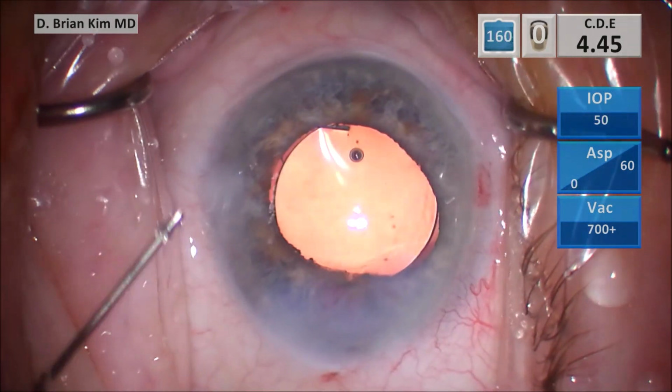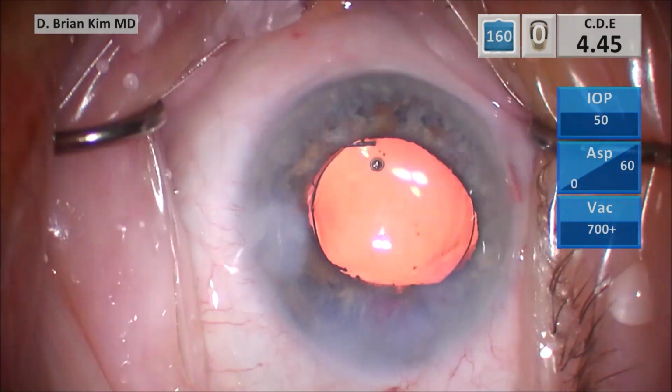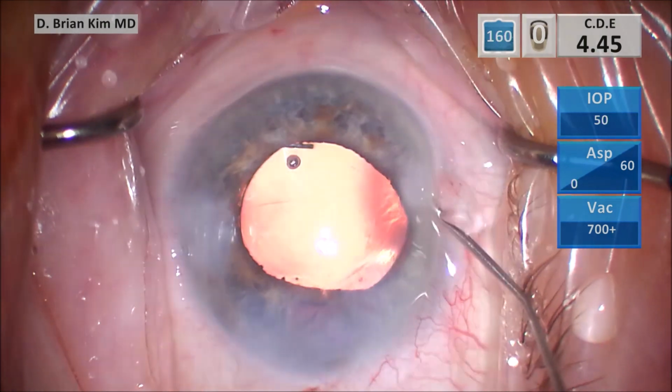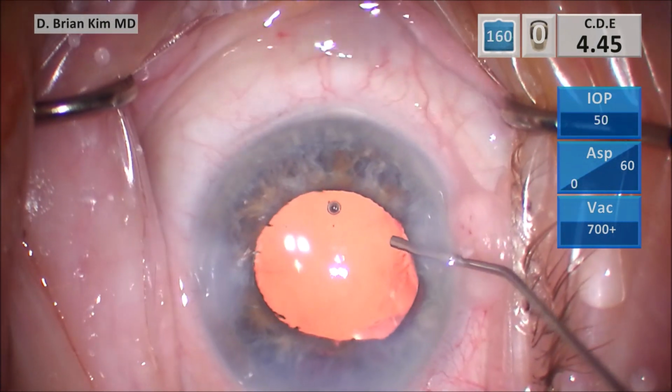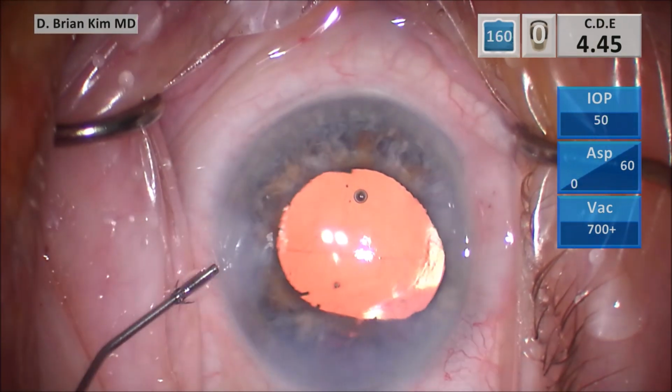And so you saw I was able to very carefully, mechanically fracture the lens pieces into smaller pieces, very controlled, systematic lens disassembly, reduce ultrasonic energy, enabling me to mindfully and carefully disassemble the lens without encountering any issues with the iris with the single subincisional iris hook.